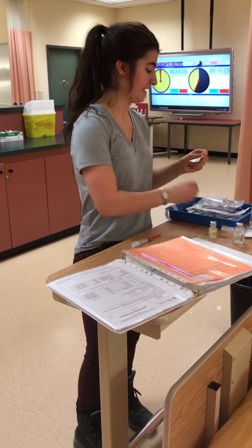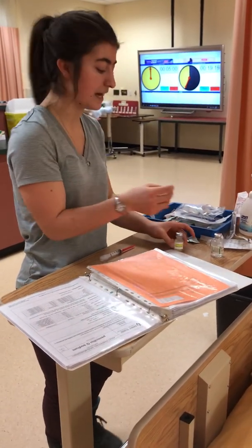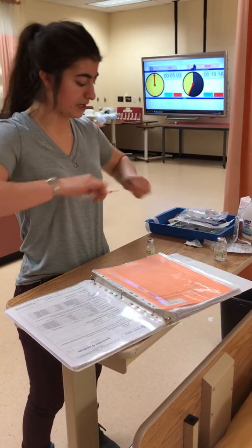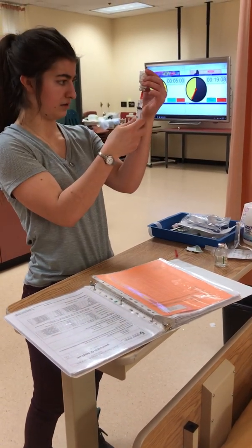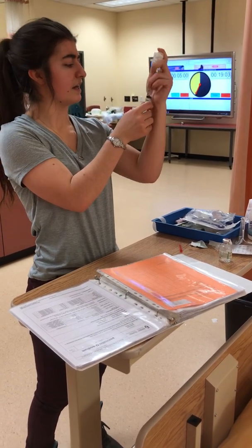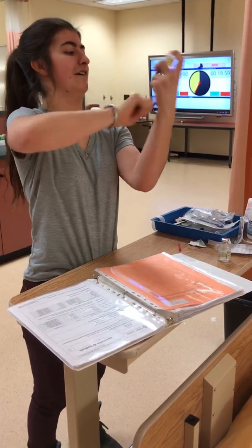I'm going to take a swab, give this a nice clean for 30 seconds, and then let dry for 15. I'm going to let 3.1 mL of air come in here. And I'm going to pull back 3.1 mL. Alright, I'm also going to get rid of any pesky air bubbles.